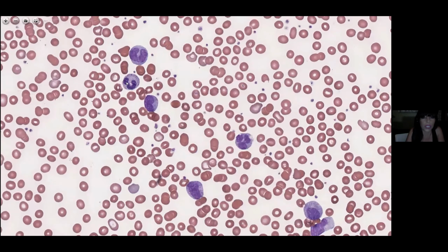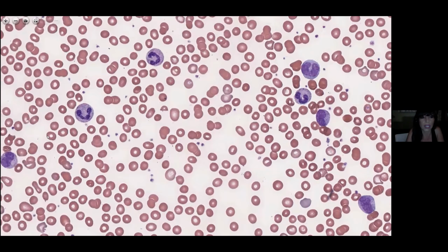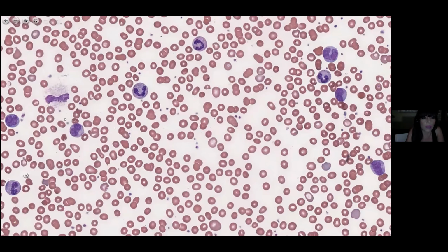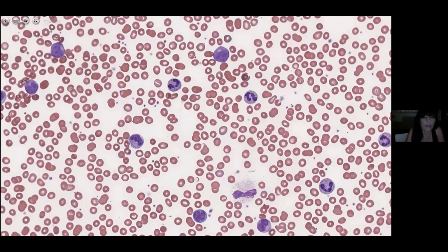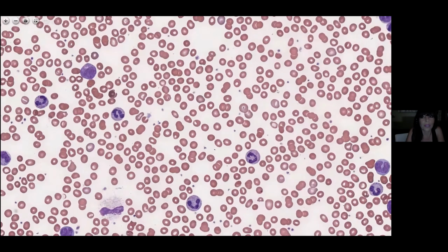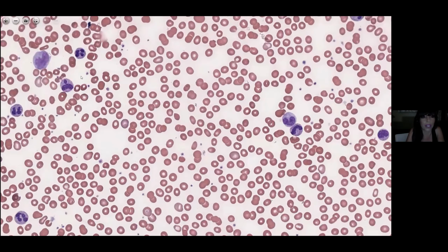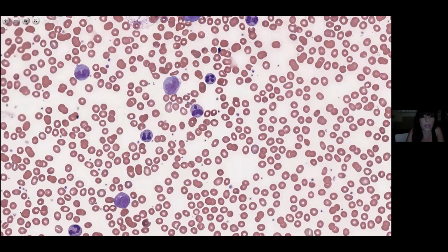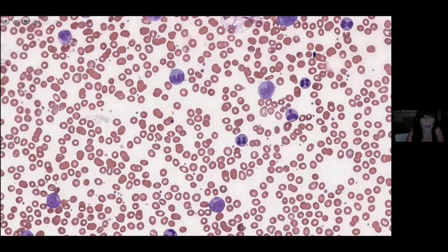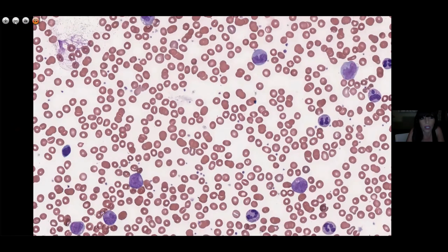There are a lot of really dark granules in the neutrophils, really dark, big, large Dohle bodies, along with a lot of bands, not a lot of basophils, not a lot of eosinophils. The monocytes, those threw me off a little bit. But again, that's why I would look in the chart and see maybe if the patient was recovering from chemotherapy, because monocytes are usually some of the first cells we see coming back. Or if someone's given growth factor, we see a lot of monocytes. Excellent, thank you.